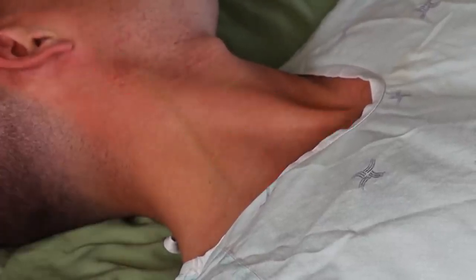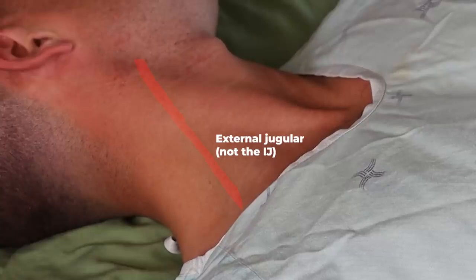By the way, that prominent visible vein on Dr. Franco's neck is the external jugular. Sometimes medical students will mistake that for the real target.